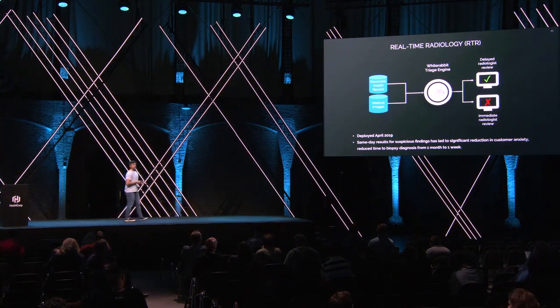This was actually deployed in our clinics in April 2019, and a lot of the immediate feedback we got was quite positive. One of them being the reduced anxiety. Typically, you'll go in for your screening exam, and it may be a month or upwards of a month before you receive the results back, or a call back saying, please come back. All this time, the patient will be worrying about this.